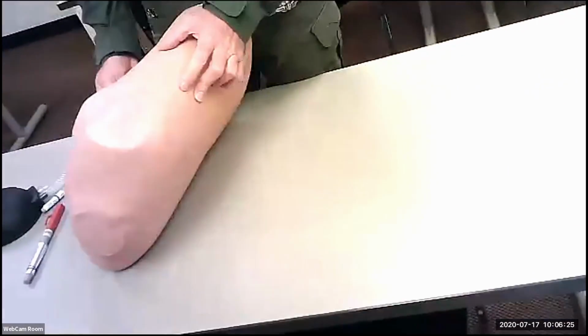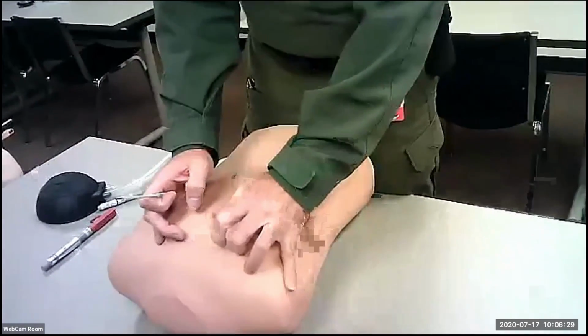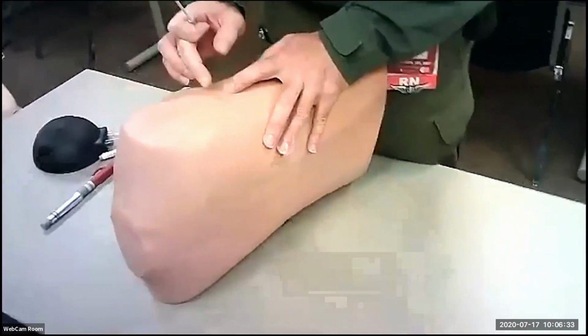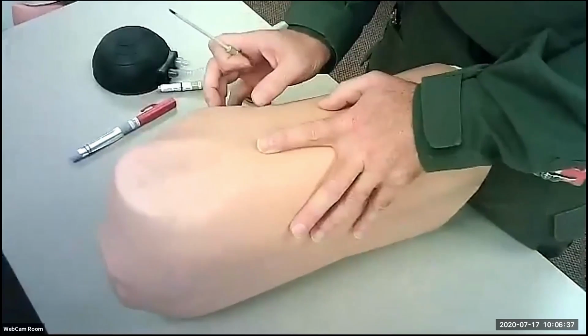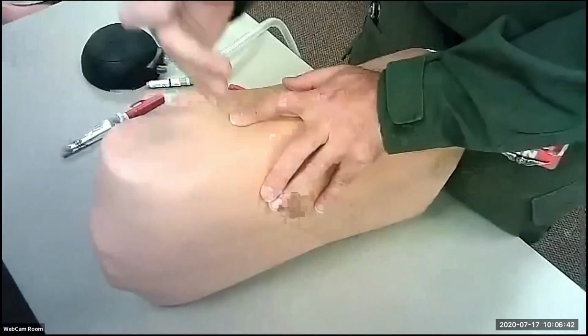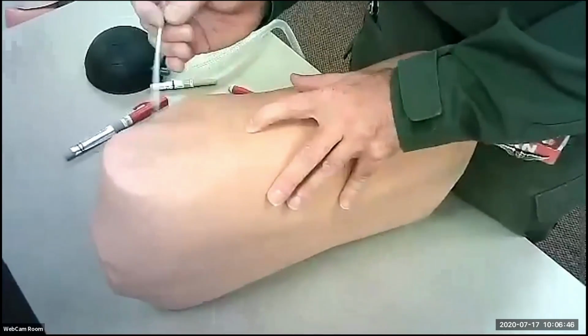PA students, anytime you needle a chest, whether they need it or not, they bought a chest tube, which means they're going to get a chest tube. That's going to go more on the axillary part. So it's second intercostal space, mid-clavicular, or fourth intercostal space, mid-axillary, so down their armpit. It's roughly the nipple line. I was told by an ER physician it's where your underarm hair stops growing. That's a great spot.